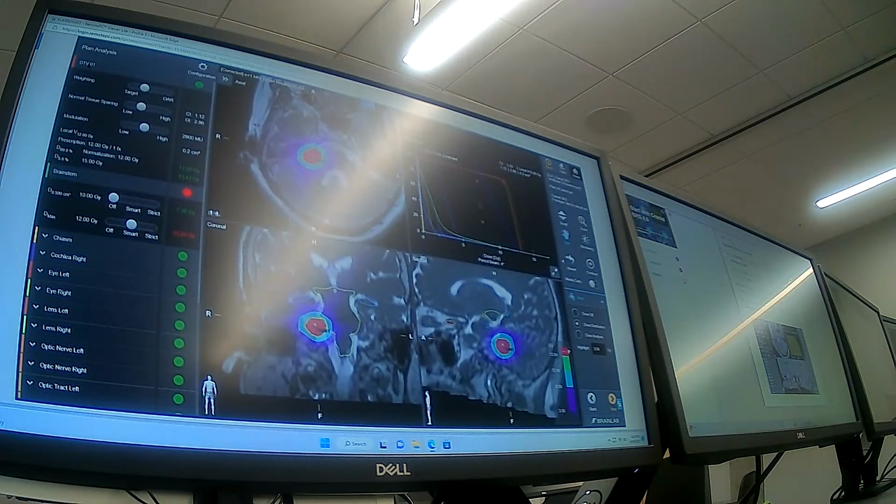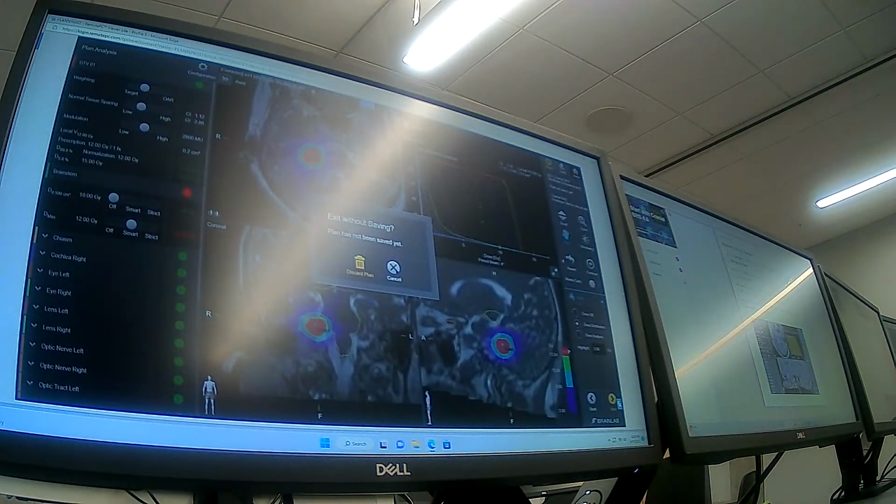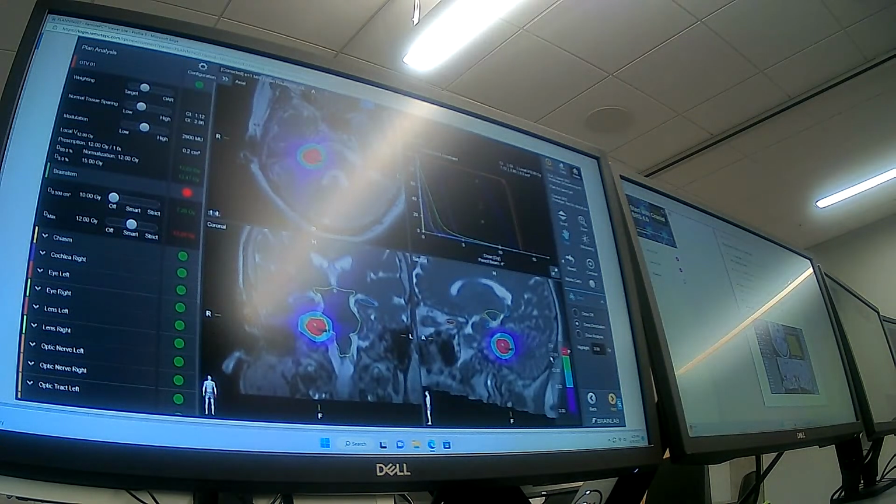Sorry. The margin on your tumor? GTV to PTV? It never really told us to set a margin again. If I use like 2 on one, 3 on somebody's 1 on 1, suddenly you have different optimization volumes for it to work with. So that's why some of the variations between everybody's planning occur.